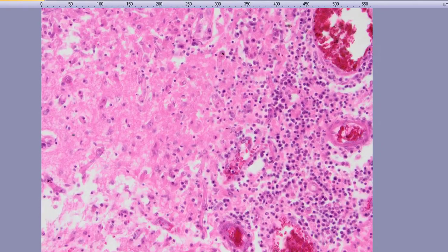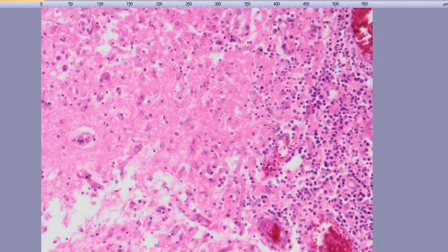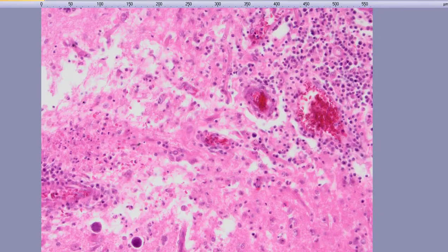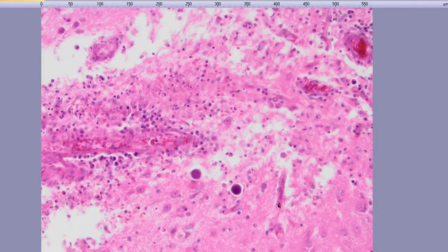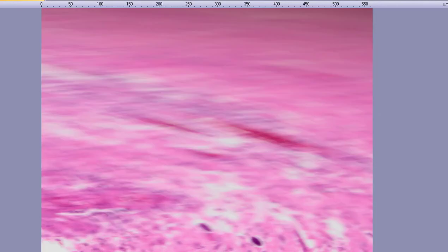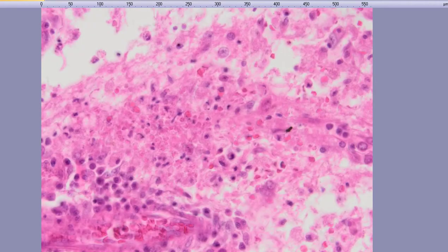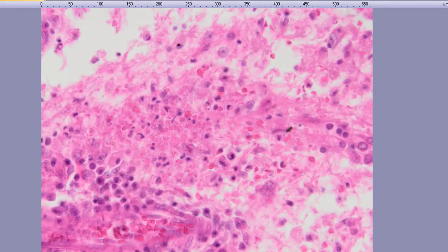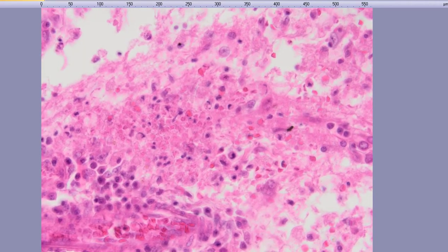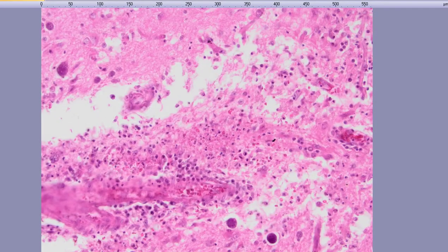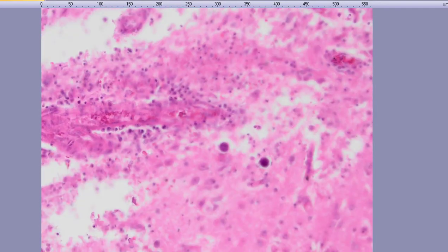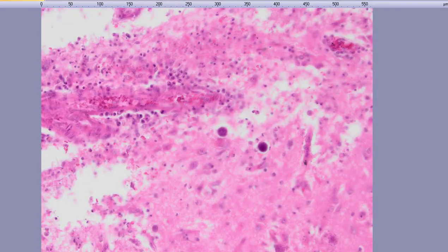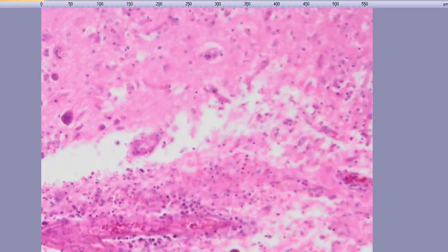You can see that there is prominent inflammation, proliferation of the vasculature here, small foci of necrosis and necrobiosis, necrotic debris here right underneath the pia mater, so a sub-pial necrosis, and the encased bradyzoites.